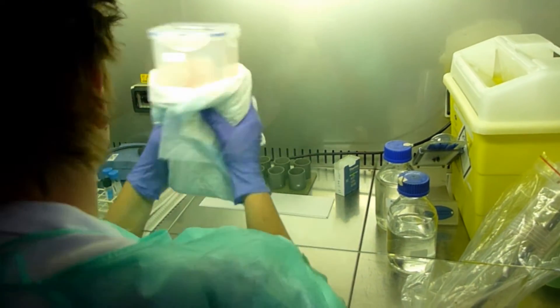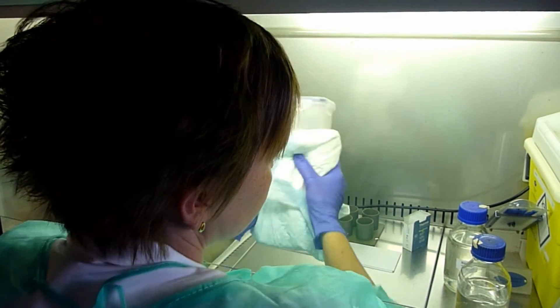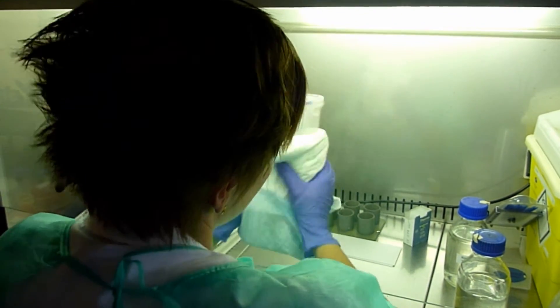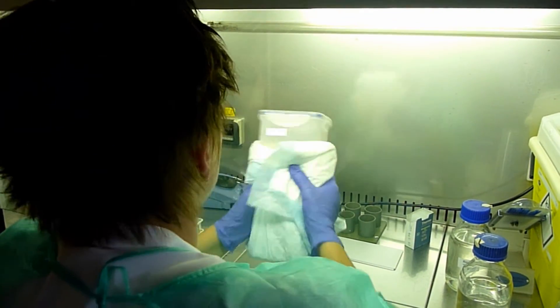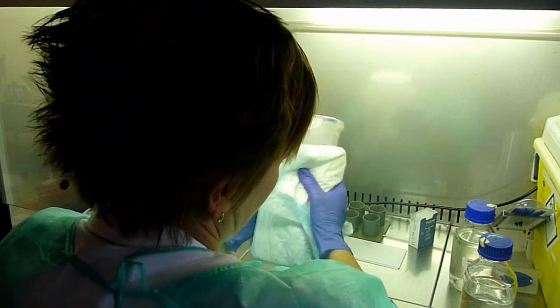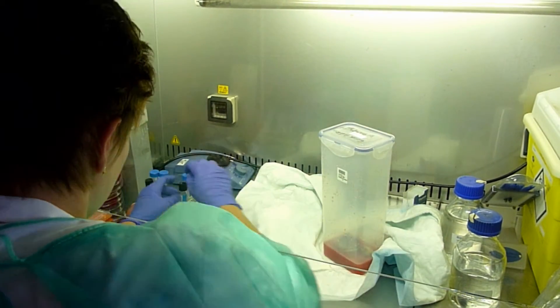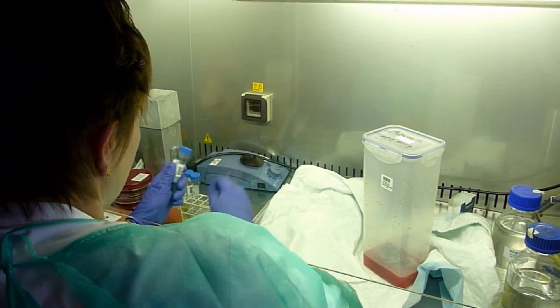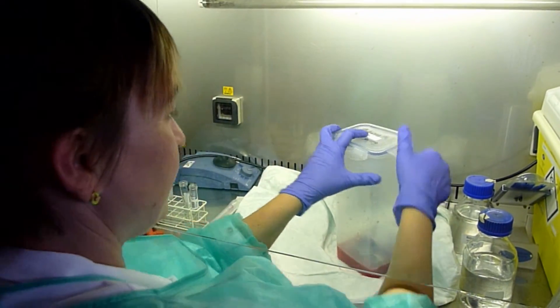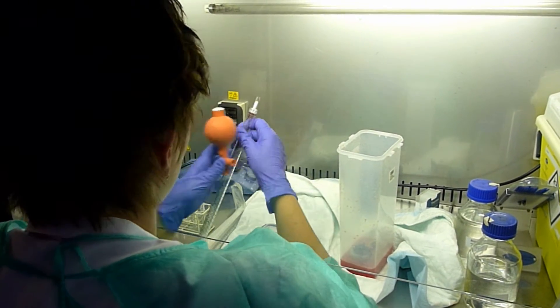And you shake it again, 30 seconds. Then you collect two times 15 millilitres in two different tubes.